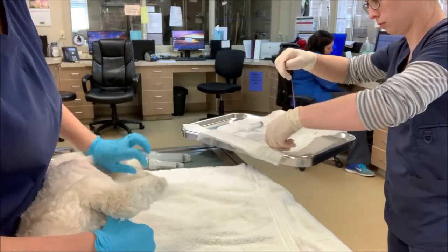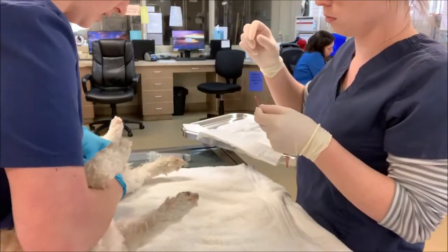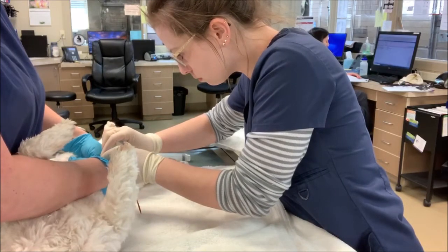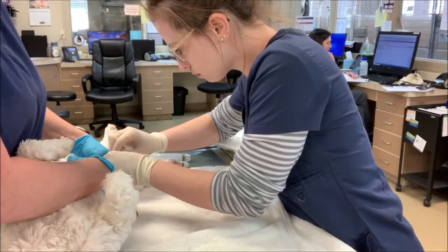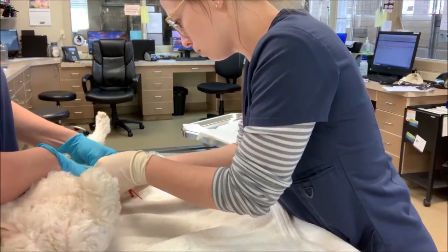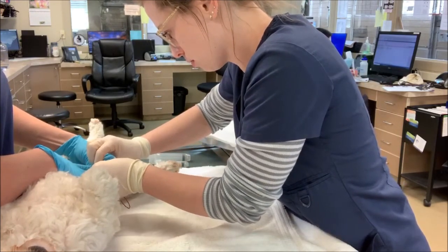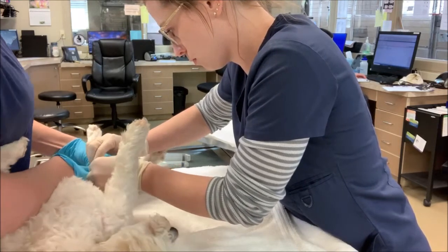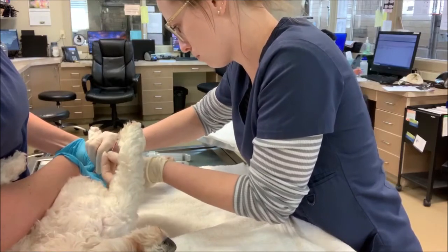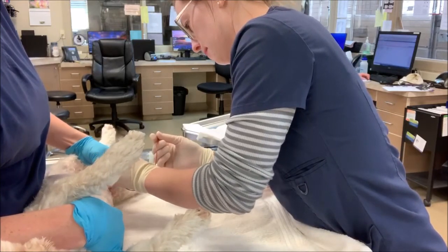I'm going to dip my catheter into the sterile gel, or lubricant. Now we're sliding the catheter into the tip of his penis. Very carefully I'm just pushing it in until we have urine flow. Earlier when I measured, I kind of eyeballed how far it would need to go in.